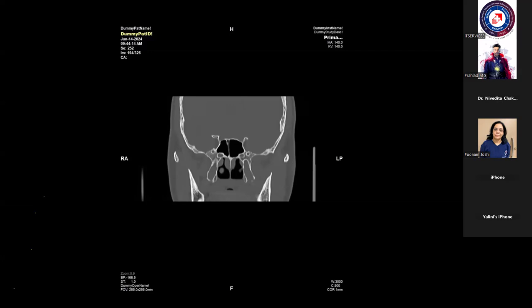And the last question, does contrast add to the accuracy of PNS detection in CT? Not for PNS detection in CT scan. Contrast is not of value on a CT scan for PNS detection. It is the indirect signs, widening of the foramen. You can see the thickening compared to the opposite side.